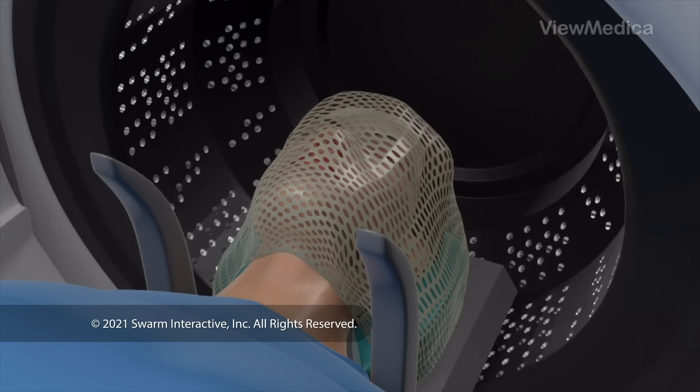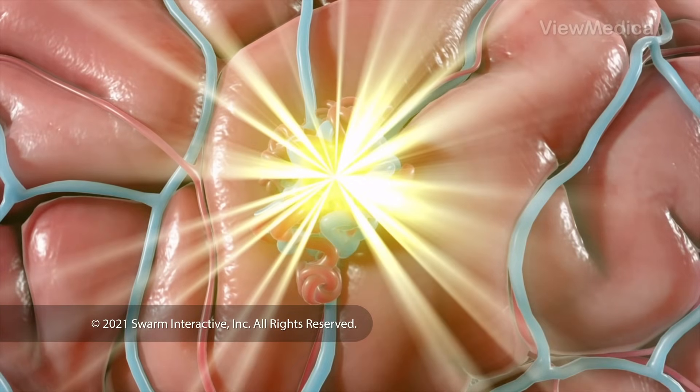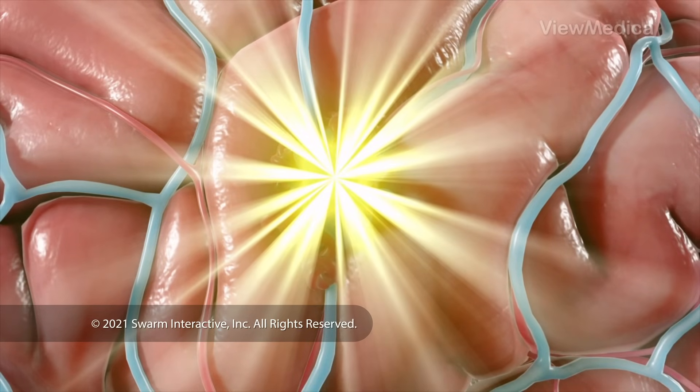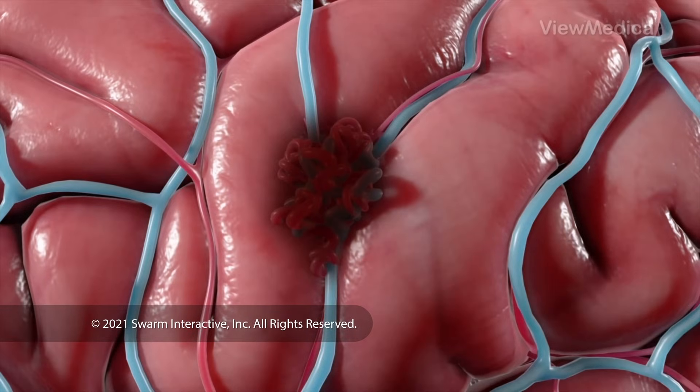On its own, each beam is too weak to damage your cells, but when we focus all the beams at a single point, they have enough power to destroy the bad tissue. So we focus the beams on your AVM. We won't harm the healthy tissue around it.